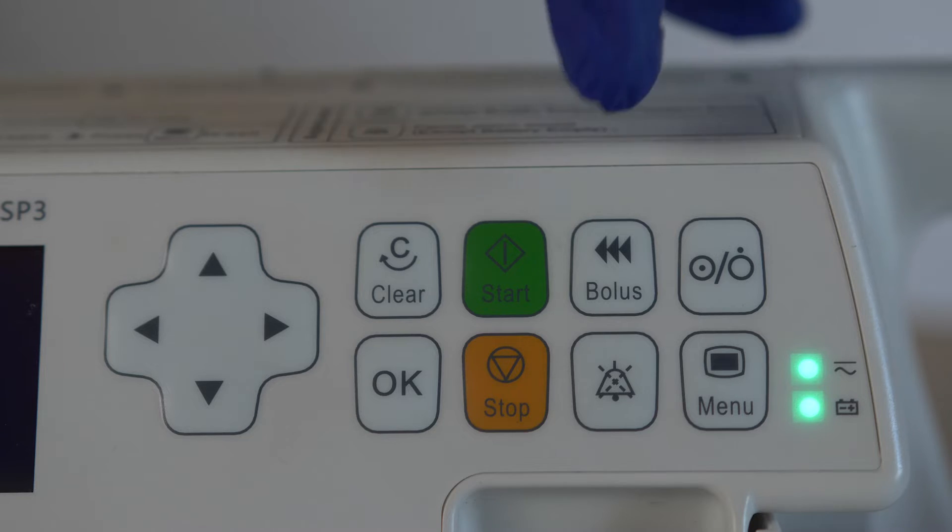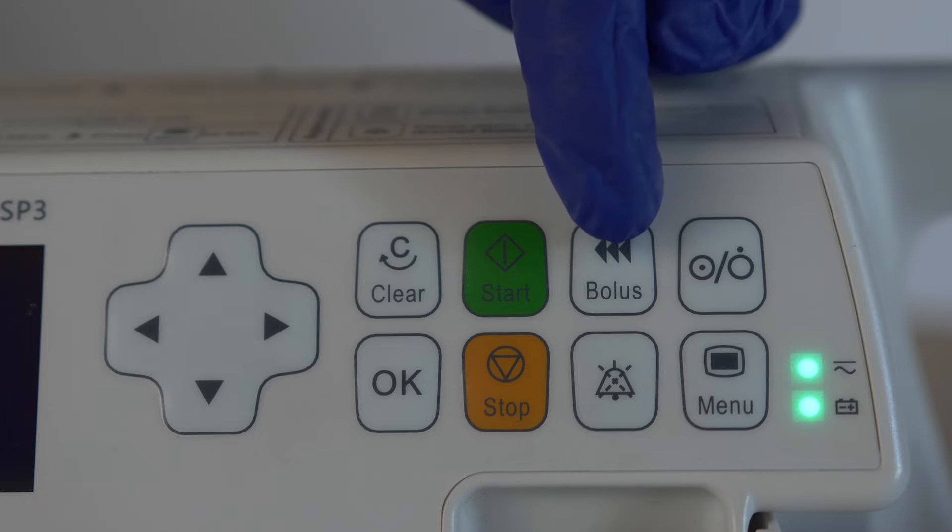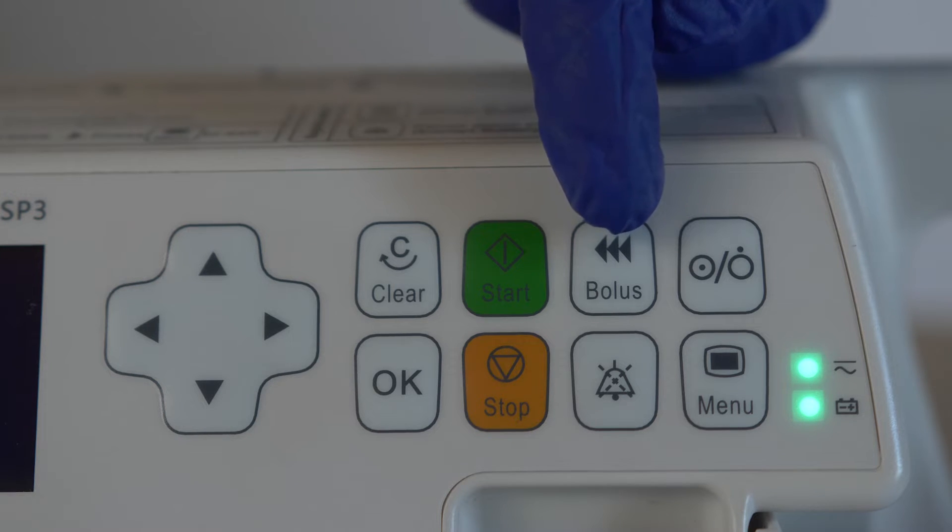You can also prime the line using the bolus function on the syringe pump. However, this will not be demonstrated in this video.